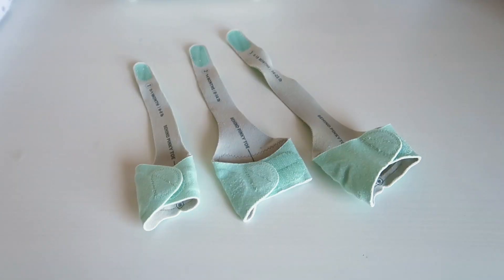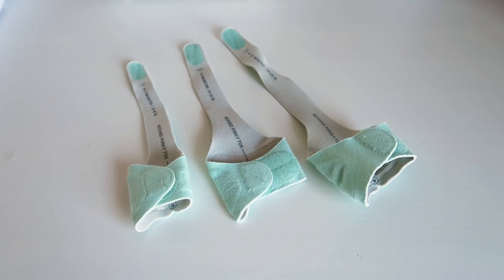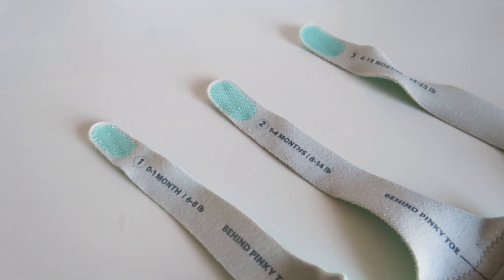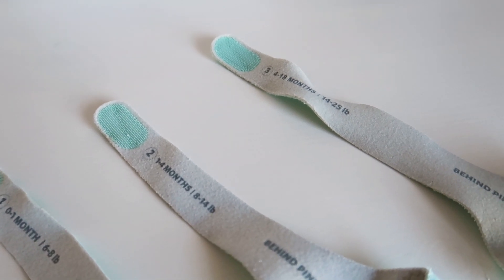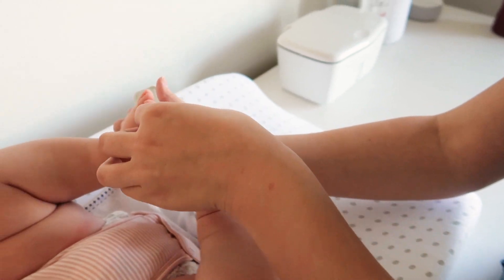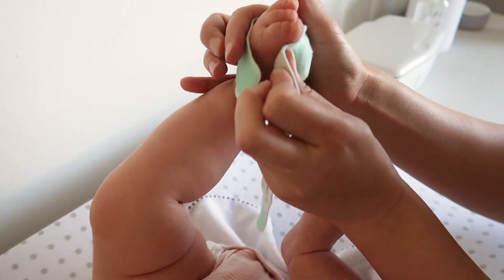Another great feature is that the sock comes in three sizes so you can use it from birth until the baby is 18 months old, so it grows with your child. It's a big investment at first but it will last a very long time. You can also put the sock on both the left and right feet — we like to put it on a different foot each night just to give her feet a break.